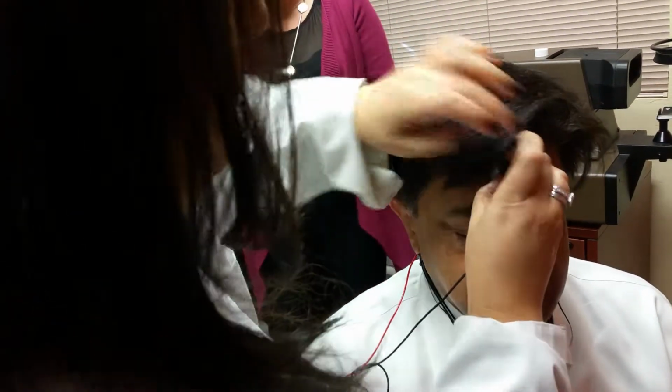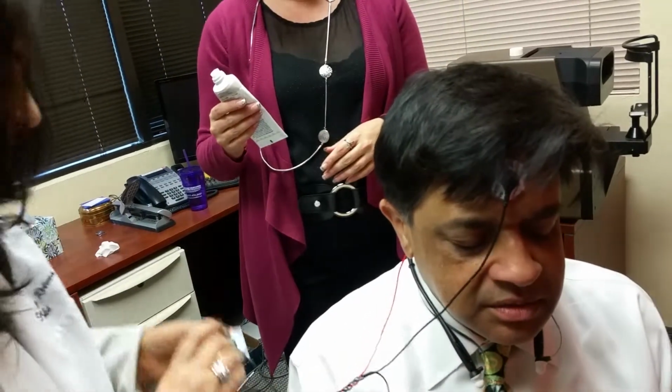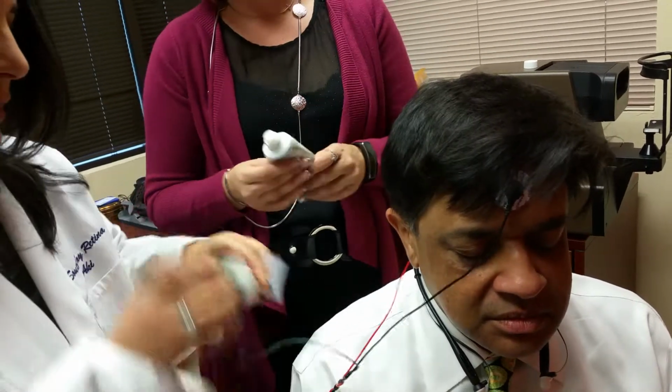We put here a little press. All 5 fingers around. Very good. And now one more. And then we'll make sure that we go underneath. Yeah, yes. There we go.